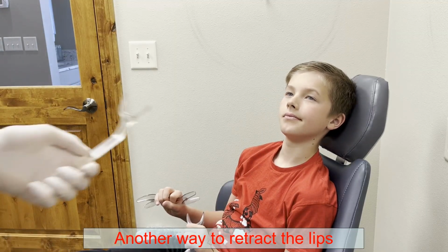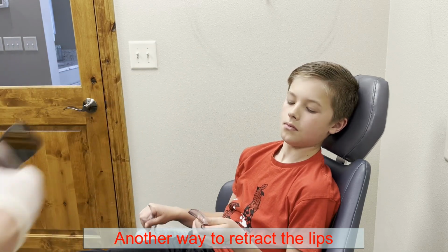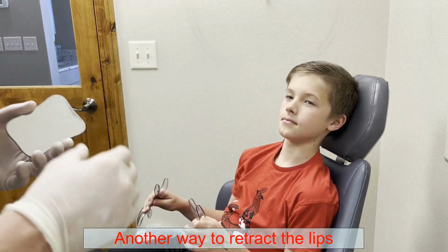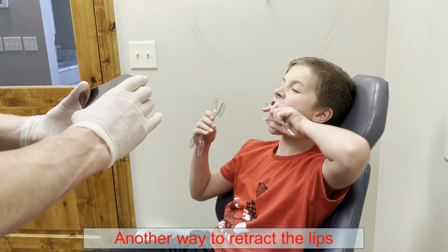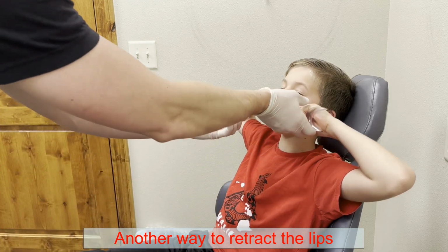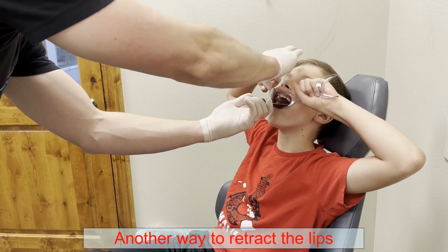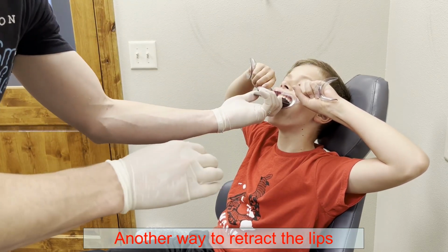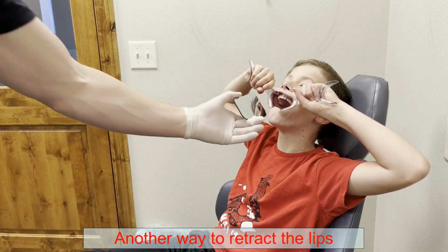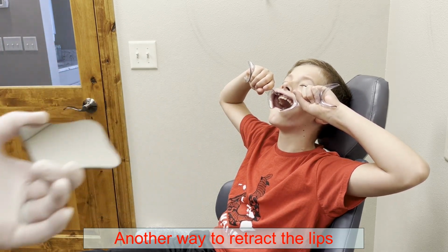Another way to hold the lip besides this, if you don't want to use this, that's fine. You can use these same cheek retractors that we use for taking the buccal shots. You just have them slide those in, and then when you go to take this photo, they just have to pull up like this and open big, big, big, and pull them apart really wide, and then you slide this in. I personally do not like this way. I think the fork works much better, but that's one way that you can also do it.